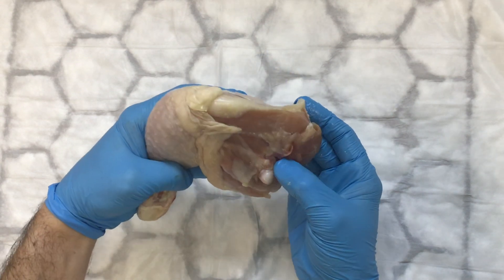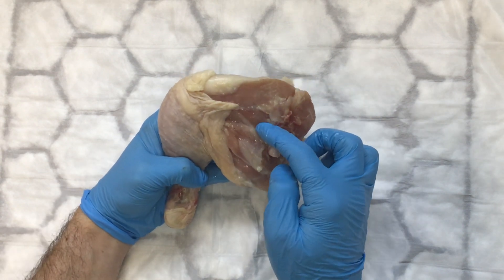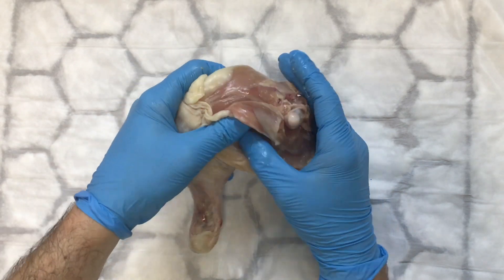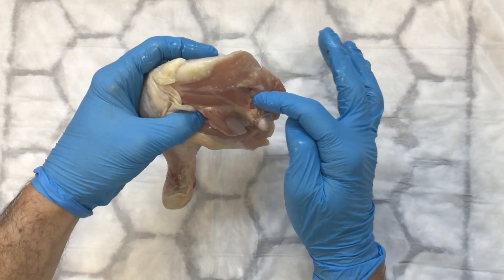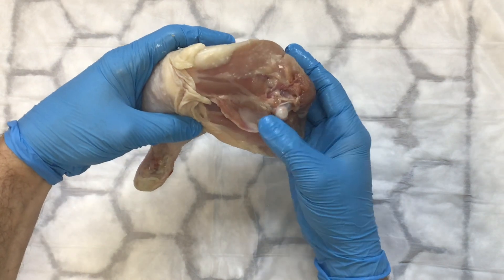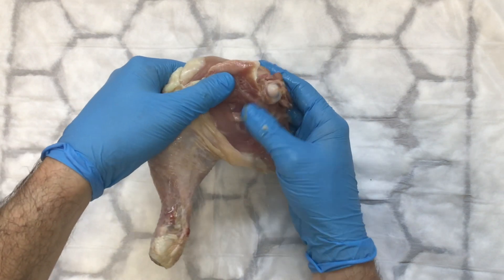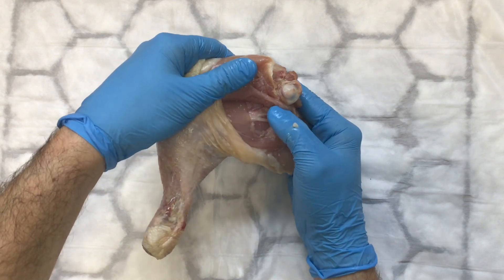If you look at this chicken thigh, you can even see a vessel poking out from here. What we need to do is go under the muscle here in the middle. There is a vessel there, so it wouldn't be unreasonable to try going through there, but normally the best thing is to go under this triangular muscle here. Just pushing with my fingers, you can see the vessels are under there.